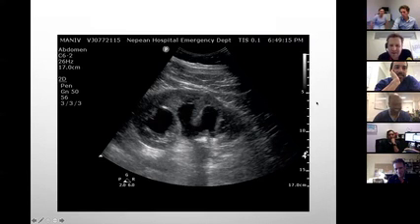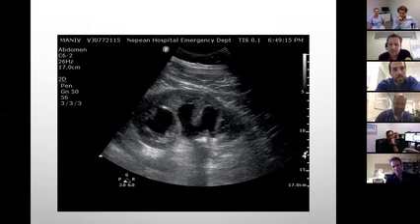Is there a stone there, Vijay? Oh God, you got the coffee bit. There is a stone in there. Technically, if it is hydronephrotic fluid, you should get posterior acoustic enhancement, isn't it? Instead, you're getting a shadow. So artifacts are really, really helpful to find the pathologies. So there's actually a stone in there. You're right. So go and nag Sam to get the coffee. You've recorded this meeting, haven't you? Yeah, I need some evidence.